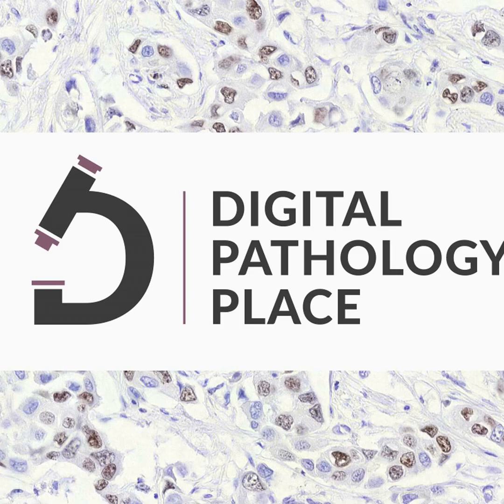An example could be a model that's being trained to recognize cancerous cells in histopathological images. The model scans the image and decides whether to label each pixel or a group of pixels as cancerous or non-cancerous. If it correctly identifies and labels a cancerous region, it gets a positive reward. If it mislabels a region, it gets a penalty. Over time, by learning from its actions and the corresponding rewards or penalties, the model can improve its ability to provide accurate annotations, ultimately leading to a more precise image analysis.